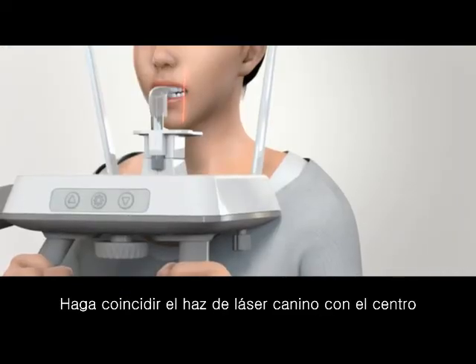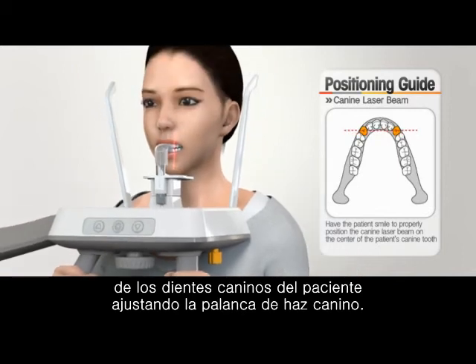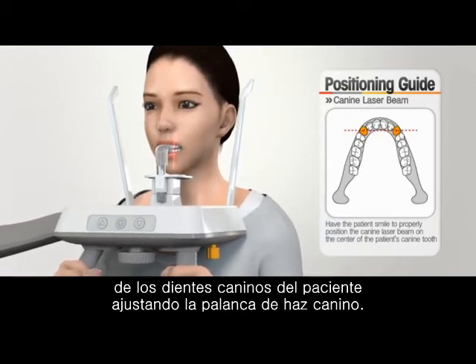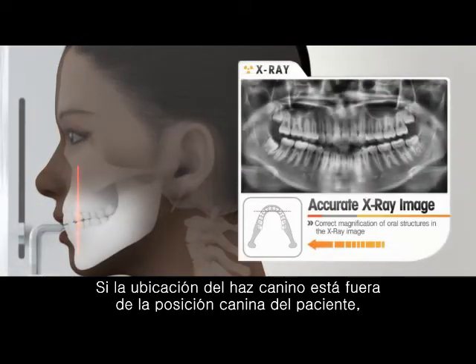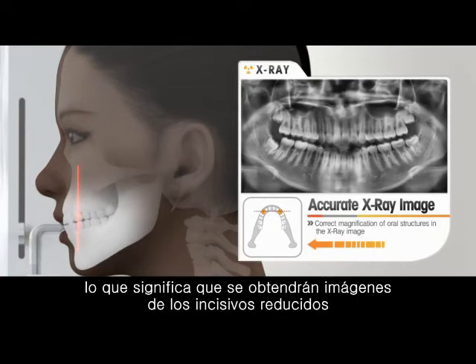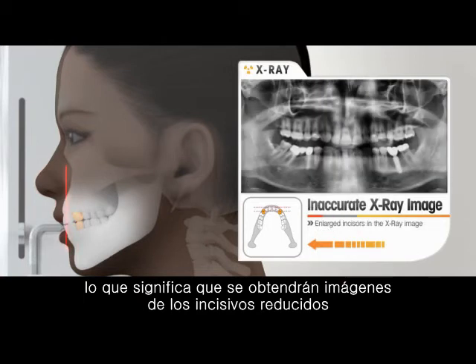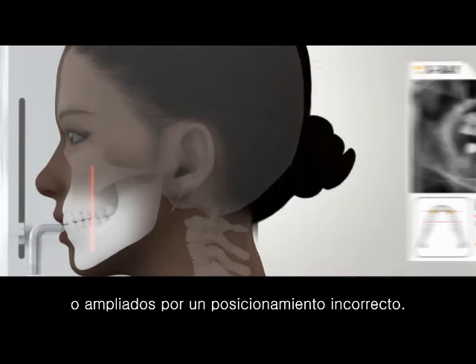Match the canine laser beam at the center of the patient's canine teeth, adjusting the canine beam lever. If the location of the canine beam is off the patient's canine position, the incisor image can be incorrectly magnified, which means reduced or enlarged incisor images are achieved by an incorrect capture layer.